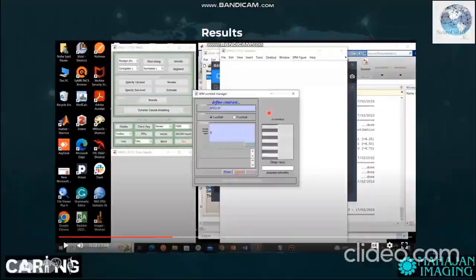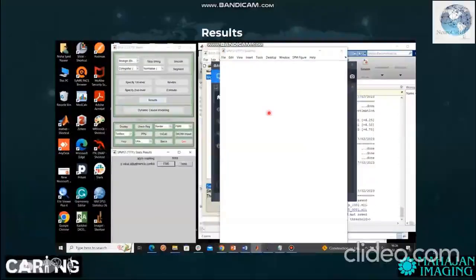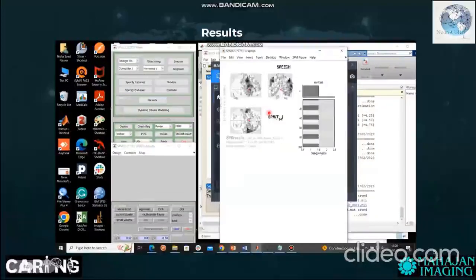And if you want to see the region of the brain activated during the speech task, you have to give speech the value of 1. Click OK, click done, apply masking none. We usually adjust the p values to FWE. So the FWE is the family wise error corrected method, which controls for a 5% chance of a single false positive. So usually the multiple comparison correction is controlled for family wise error rate, and you can enter a p value of 0.05. Extent thresholds more than 0.